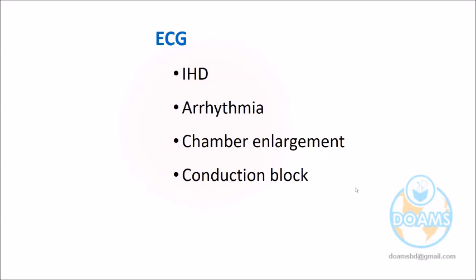For me, arrhythmia is important. Why are you choosing arrhythmia? Because in most cases it will not be stable and needs to be referred, needs to be evaluated more. Okay. Anyone else? Any opinion in favor of chamber enlargement or conduction block? You never thought of this before.